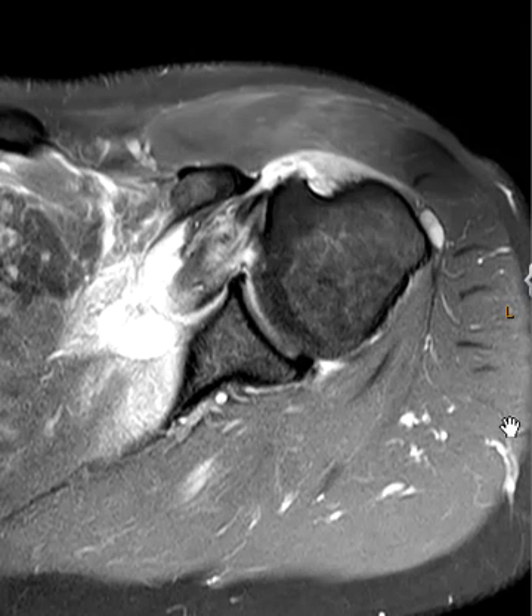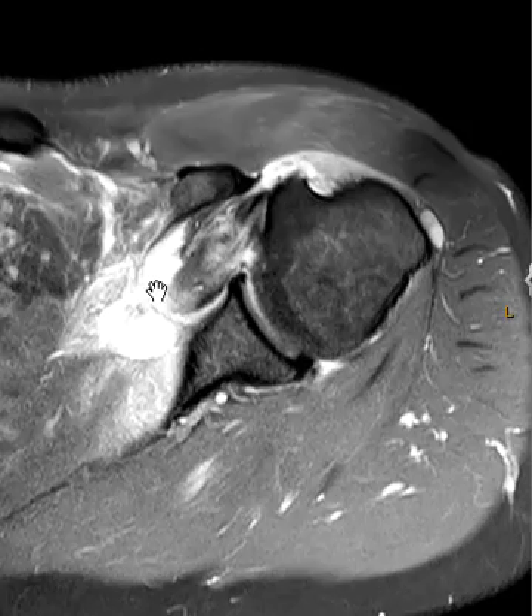Hello, this is Dr. Gay from FirstSuck MRI. This is a 51-year-old male who had a recent slip and fall injury and shoulder pain, and we can see why — in the front of the shoulder here there is something going on that looks pretty significant.